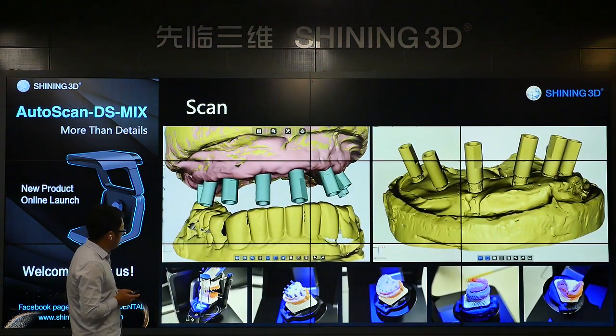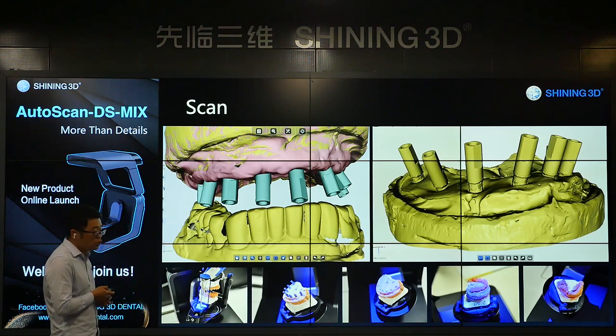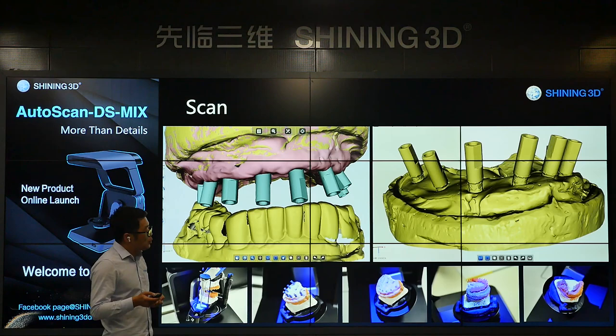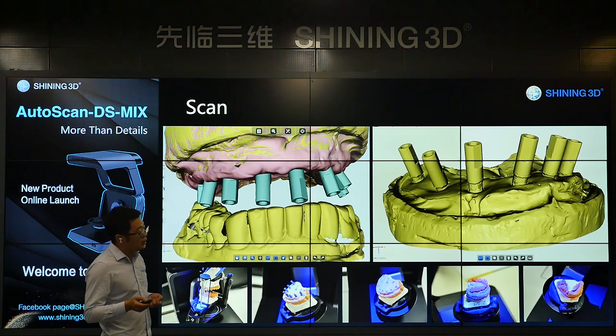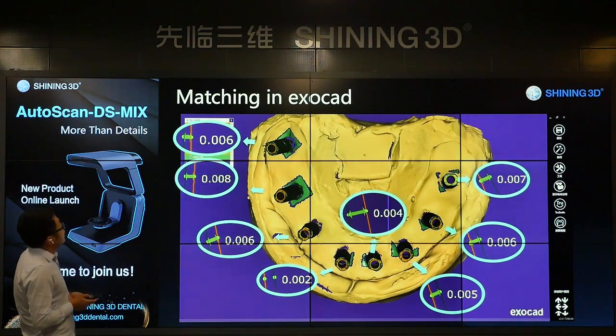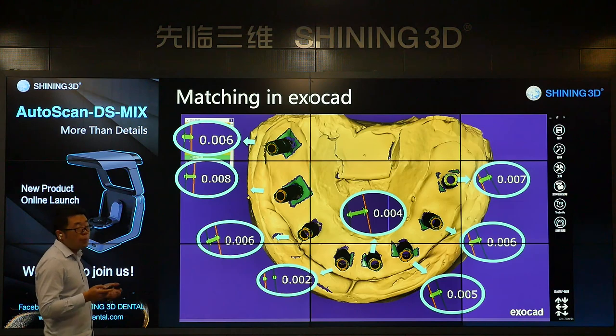So the scan, just like the last case, first we need to scan the total jaw up and over. Then scan body, gingiva, and the simple bridge made by hand. Then the antagonist. Okay, here is the magic effect. Now we can check. All the figures are balanced and less than 0.02. So it's amazing.